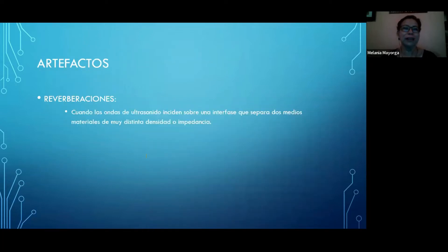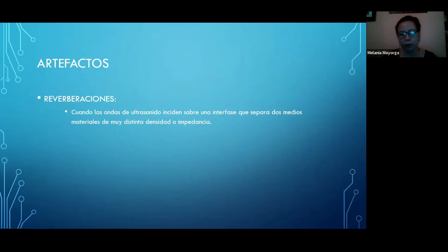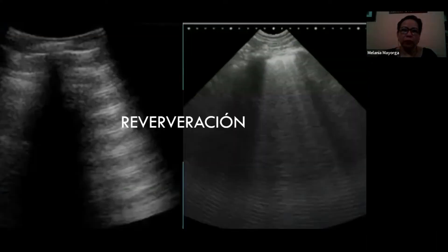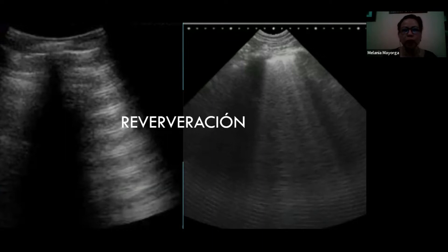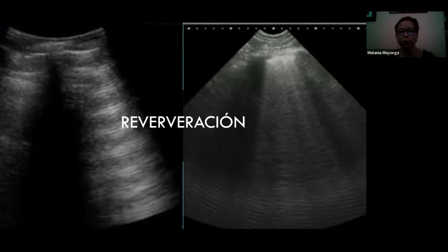Como primer artefacto vamos a ver las reverberaciones. Cuando las ondas de ultrasonido inciden sobre una interfase que separa dos medios materiales con muy distinta densidad o impedancia, nos van a dar artefactos. Las reverberaciones principalmente las vamos a notar cuando nos topamos con gas. En el abdomen nos van a hacer un artefacto que va a evitar que podamos ver órganos más profundos, pero también nos van a ayudar en el diagnóstico clínico si el paciente tiene alguna lesión que provoque gas a nivel abdominal.